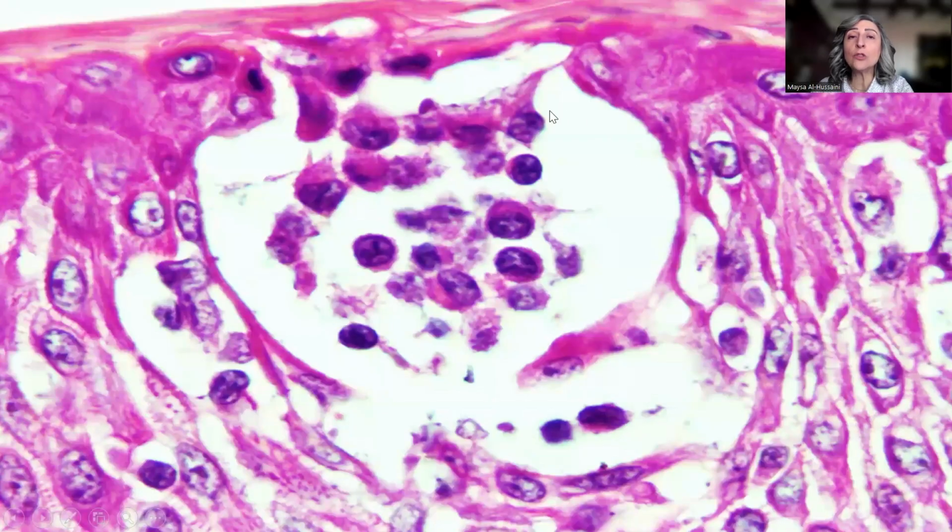Now, zooming into the morphology of the cells, we can see some degree of atypia, not the usual atypical cerebriform pattern of nuclei that you would expect with the typical mycosis fungoides, but still the overall appearance, the collection of the cells would really bring this important differential diagnosis into the mind of the reporting pathologist. Now, there is some degree of spongiosis, which is kind of unusual in mycosis fungoides, but sometimes can be seen, especially if the patient attempted some local medication.